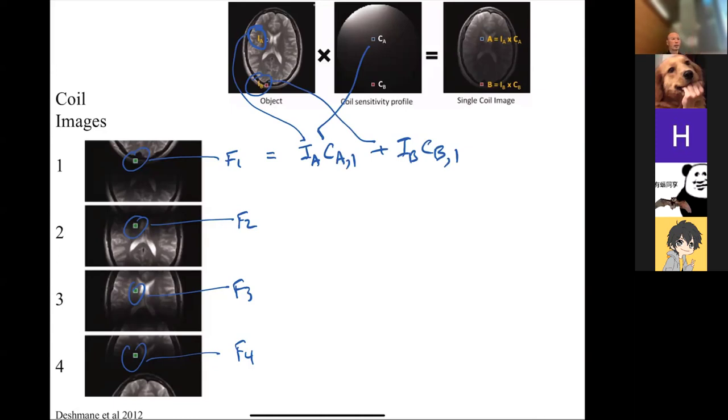Yes, question? How do you know what 2 voxels will be on top of each other? Because you know the Nyquist theorem, so you know what the interval of replication is going to be. Once you set, for example, your delta K Y, you know the image is going to replicate every FOV. So typically we say delta K equals 1 over FOV, right?